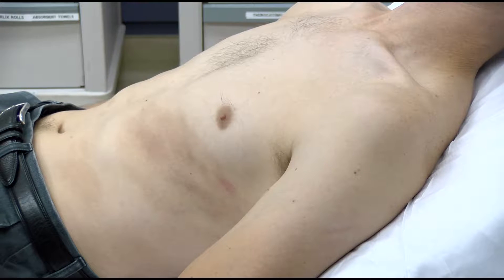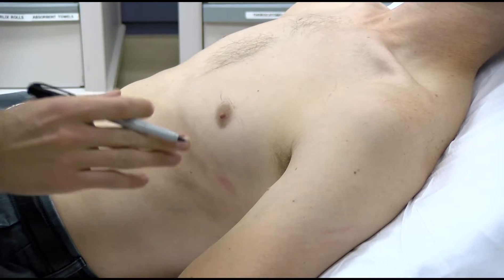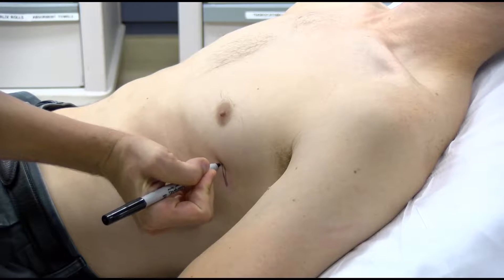This video will guide you on the steps to perform a tube thoracostomy or chest tube. This procedure is performed to drain liquid or air that has accumulated in the thoracic cavity and is impairing lung expansion.